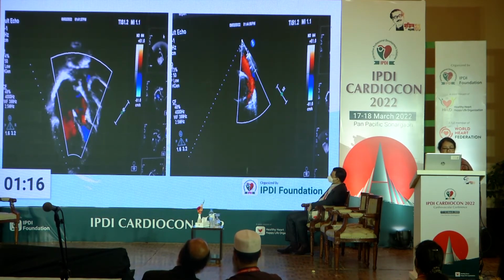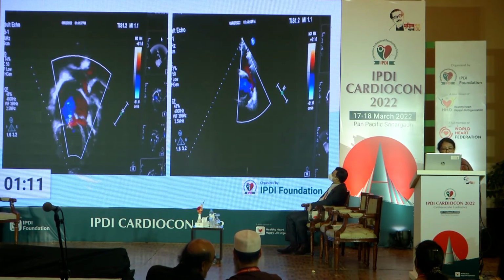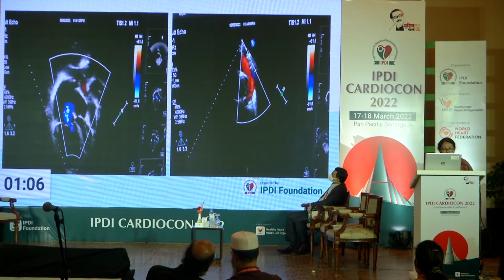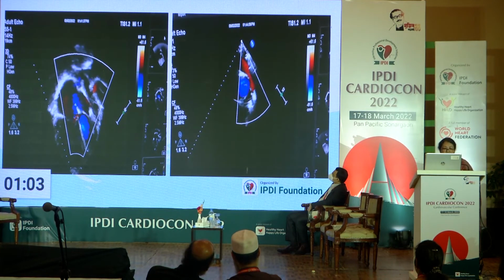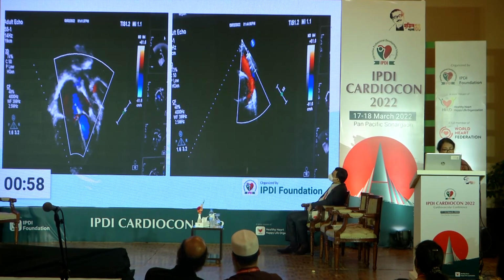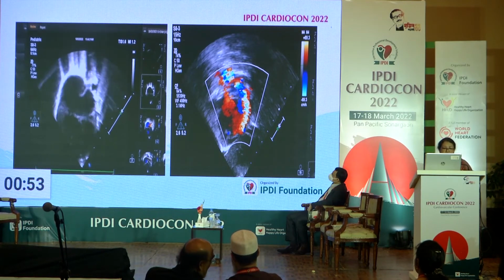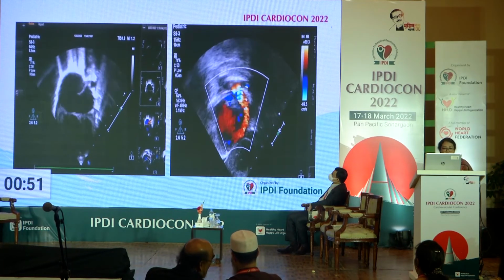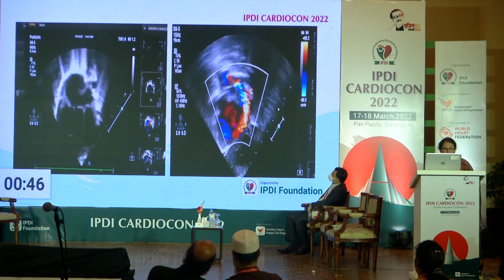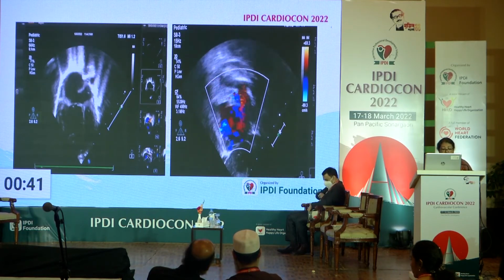This elderly patient was sent for echo as ASD with severe pulmonary hypertension. During echocardiography, we didn't find any pulmonary veins entering the LA. Rather, we saw that the pulmonary veins form a venous complex behind the LA, and in the suprasternal view we are able to see the vertical vein. This is supracardiac TAPVC. This five-month-old was advised for echo as outside it was detected as primum ASD, but this is not a primum ASD; this is a dilated coronary sinus, and we are able to see all four pulmonary veins drain into the coronary sinus.